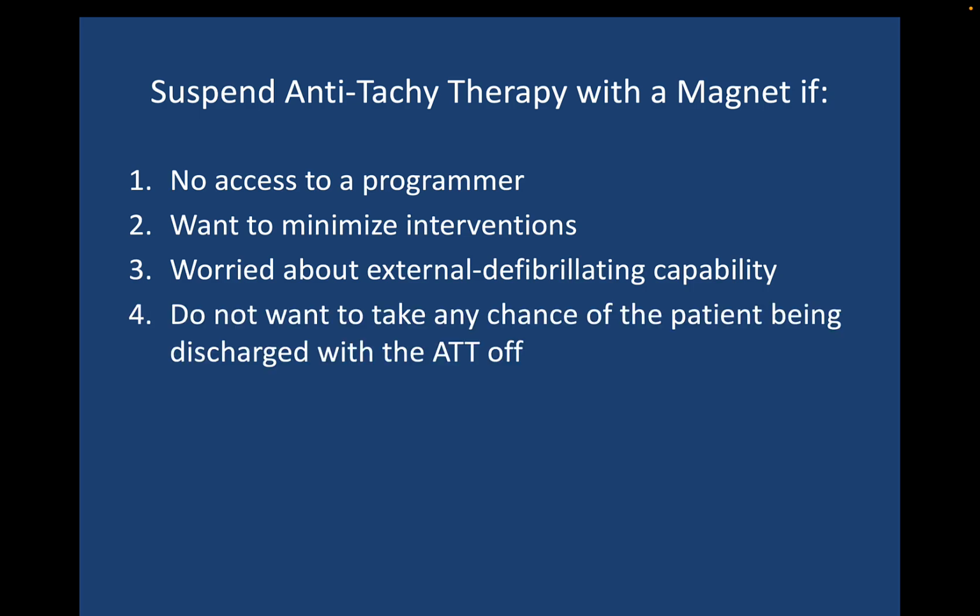And if you don't want to take any chance of the patient being discharged with the anti-tachytherapy off, again, a magnet is a good way to go. If it's no problem turning it off, but at the end of the case, in the middle of the night, you're worried that the patient's not going to get the device turned back on. It's going to be the weekend.